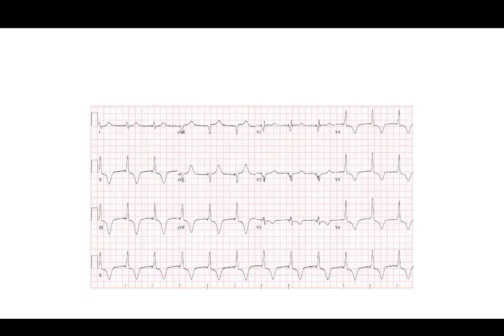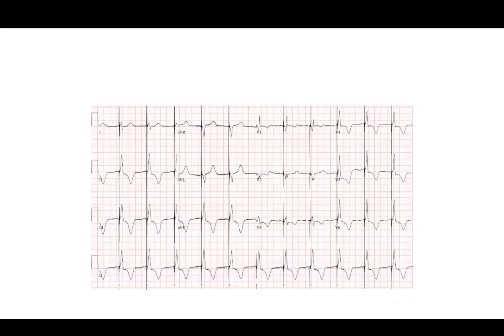But for me, it was more the importance of rechecking these immediately afterwards in the day unit, because most of the time I do the programming in the operating room, and then they go off to be seen in a month or a month and a half in the device clinic. But I think it's made it a little bit. Sorry, those are all me. And that was it.